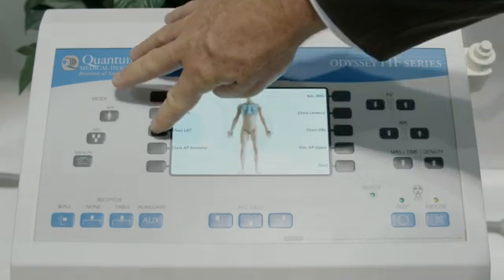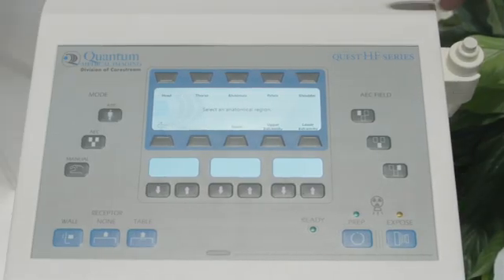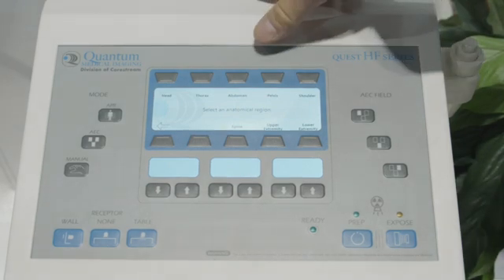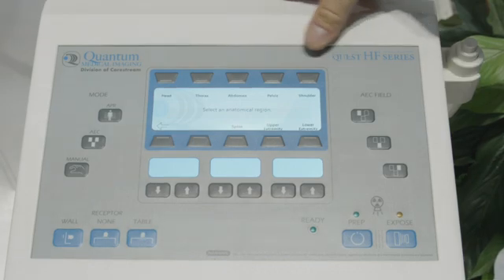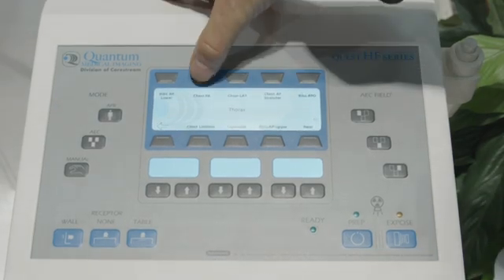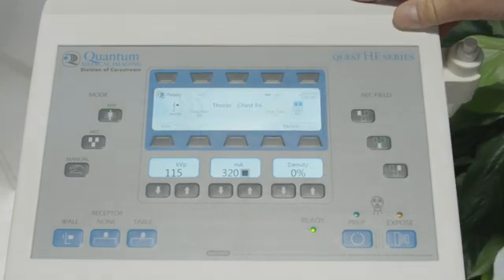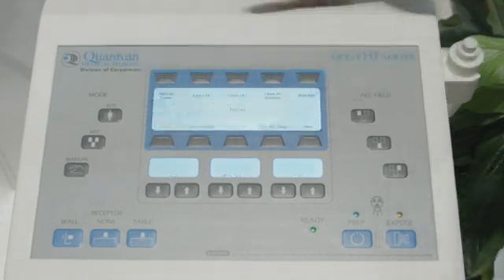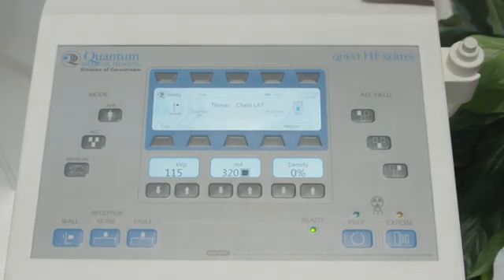If I go back, I can select the chest lateral and we're ready for the second exposure of that two-view chest. In the Quest example, for the chest PA, the Quest generator is text-driven, so here we select thorax, chest PA, the technique is configured, and it's ready to shoot. To go to the next view for the lateral, we select lateral, technique is applied, and we're ready to expose.